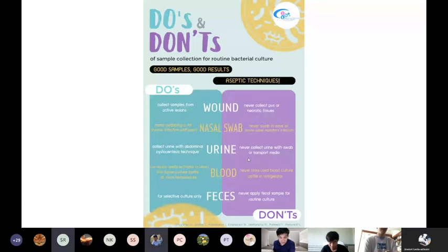There are 2 questions in the comments box. The first one is from Peter, who asks to please explain why we should not collect urine with a swab or transport medium. From only my opinion, I think that swabs and transport media sometimes have a lot of contaminants from the GI tract or the environment, and the causative agents will be fewer than when we get it as fluid, 3 milliliters or more, and do colony forming units to solve the quantitative cutoff too.